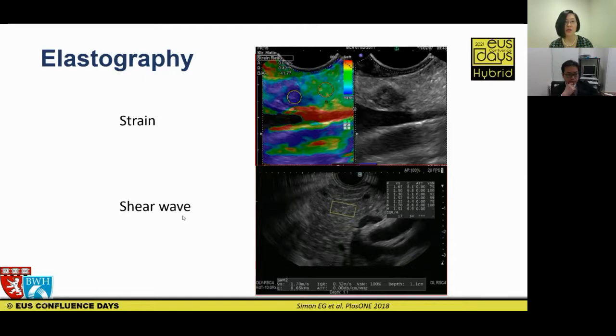And contrast that to what we see during shear wave elastography, where you don't see all these lovely colors. Instead, you see this yellow rectangular box here around the area of interest. And typically when you're doing this, you want the lesion to be at about the 6 o'clock position from your transducer, about 5 to 10 millimeters deep.